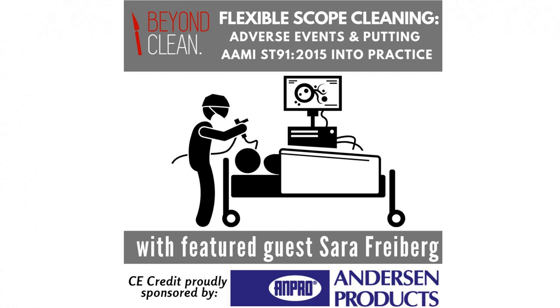And I've known Sara for a while now, Mike, and I think the takeaway for me, stressing the importance of point of use cleaning. I was really glad to hear that the Joint Commission is beginning to take a special interest in focusing on this matter because once blood, bioburden, or biomatter of any type dry up on an instrument, let alone inside of a flexible scope, even on a basic stainless steel instrument, once it dries, it begins to eat away at that passivation layer. It causes pitting, rusting, corrosion, and the biggest issue being cross-contamination. We want our patients to have safe care, and it really does begin at the point of use. So I just thought that can't be stressed enough, and it was great to hear Sara's passion for that topic as well.